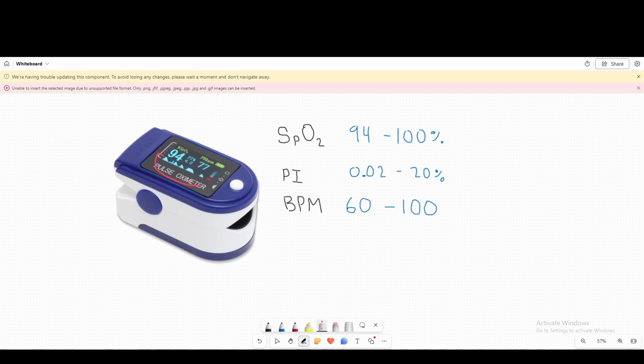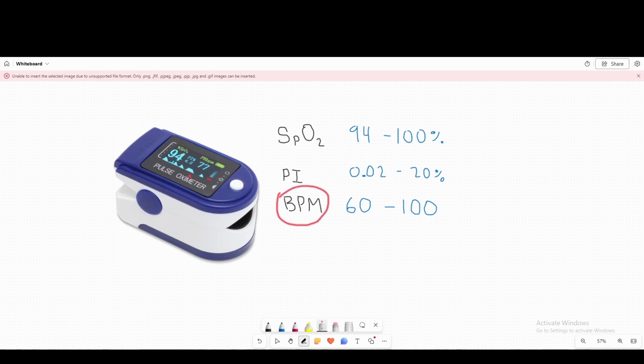As you can see on this pulse oximeter, you've got a waveform. This is charted the amount of light that it's detecting over time, and this is how it calculates the beats per minute. And you get this nice little graph here, which we'll be going into later.